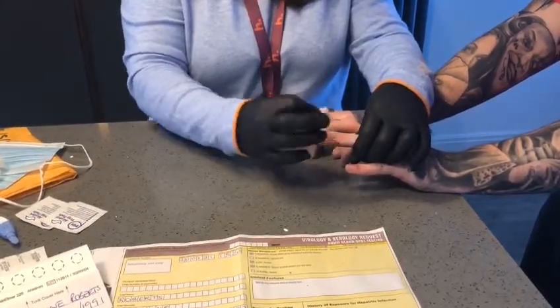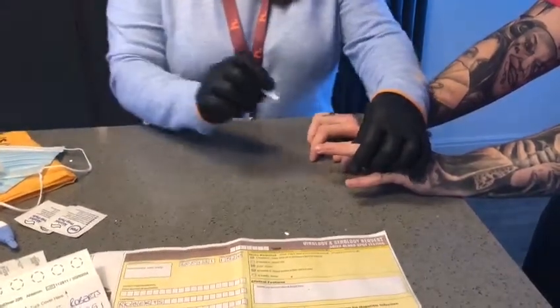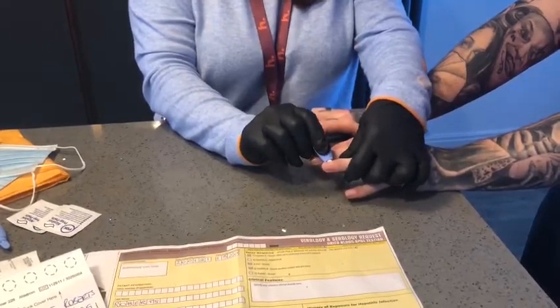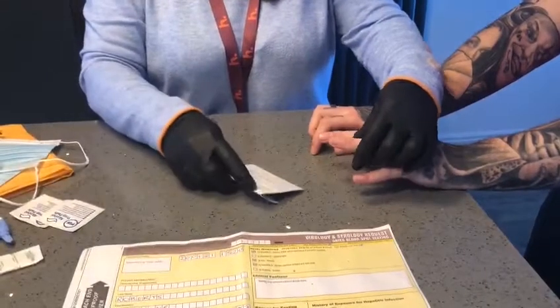Please try and avoid the nail bed and the pad. The next thing that you're going to do is to press the lancet against the skin and push it in until you hear an audible click. The blood will now start to flow.